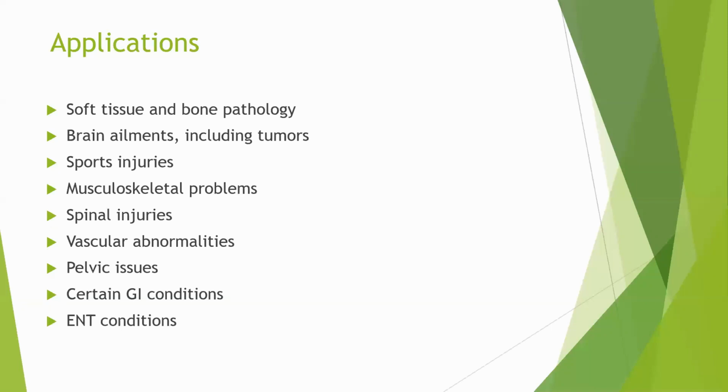But if you evaluate spine and you don't see a pelvis, that is a problem in the MR. You have to probably order a review or redo the MR with the pelvis, because it is extremely important as an osteopath and a chiropractor for me to understand what is going on in a lumbar spine in relation to sacrum and the innominate. If I don't see it under MRI, then I don't have a complete picture of what's going on in the lumbar as well as the pelvic area.